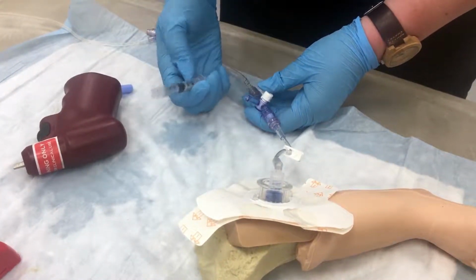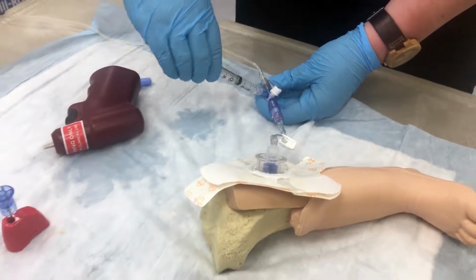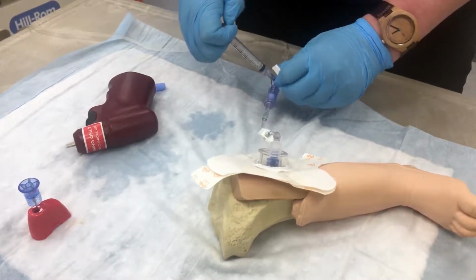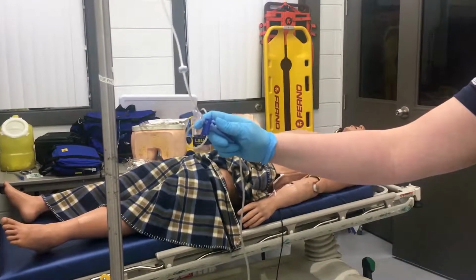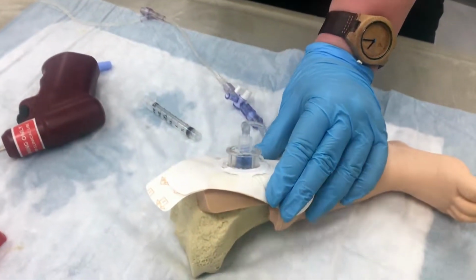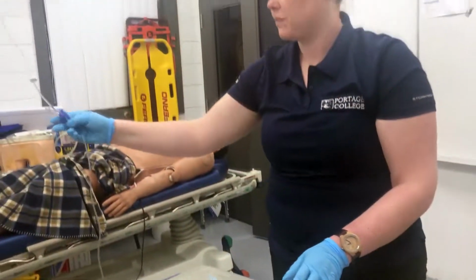Confirm catheter placement with the following recommended methods: stability of the catheter in the bone, ability to flush the catheter, and adequate flow rate. Attach IV tubing to the stopcock and infuse fluid at the desired rate. Reassess patient, monitor insertion site frequently for extravasation, and describe documentation and patient care required with IO infusions.